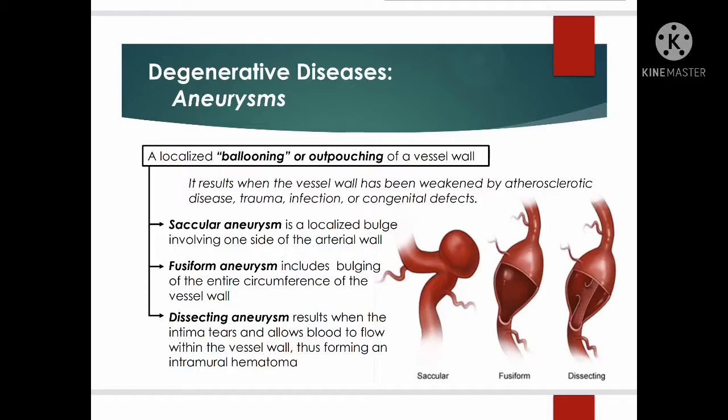An abdominal aortic aneurysm is usually seen using a cross-table lateral abdominal radiograph. It is visualized as an enlargement of the aorta and calcification of the vessel wall. Diagnostic ultrasound, MRI, and CT scan are used to determine the size and extent of the aneurysm. A thoracic aortic aneurysm is caused by a congenital anomaly or blunt chest trauma, while CT, MRI, and transesophageal ultrasound assess the size and extent of the aneurysm.